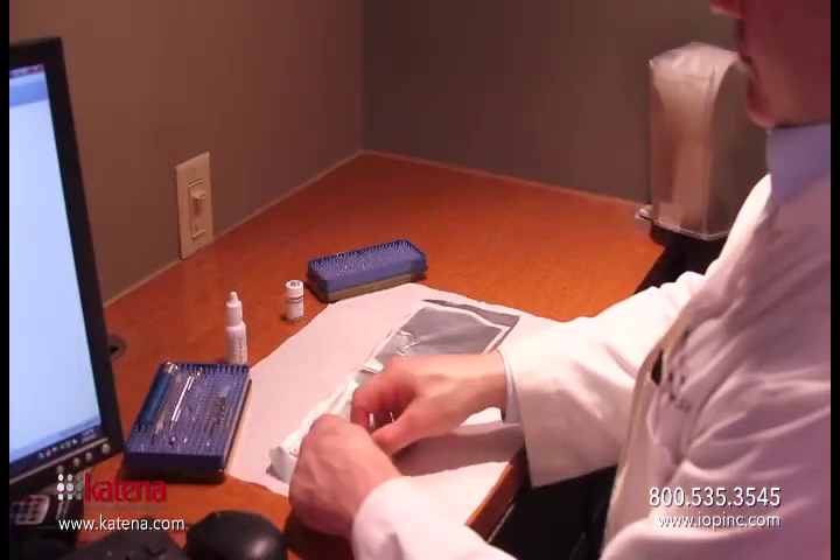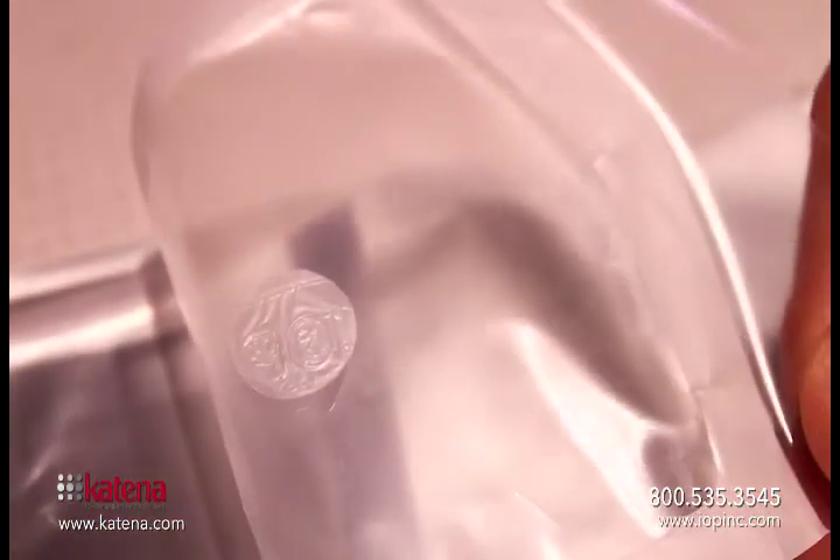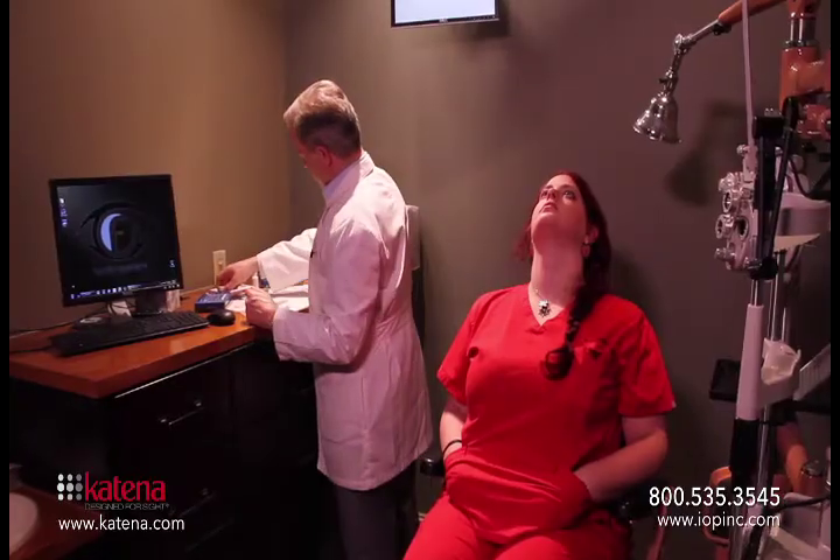You want to be careful opening this so as not to dislodge the AmbioDisc itself. When you open it you'll want to observe the orientation of the markings on the AmbioDisc. You're looking for an IOP marking on the disc to show you its orientation.